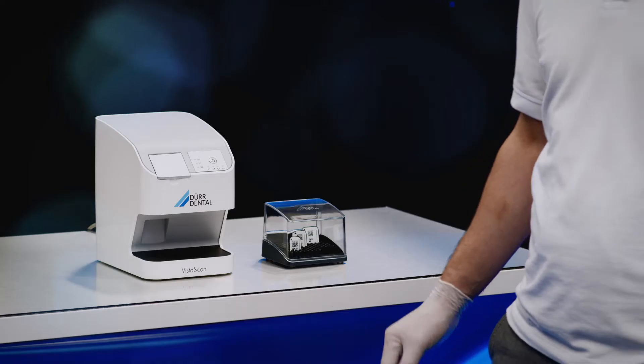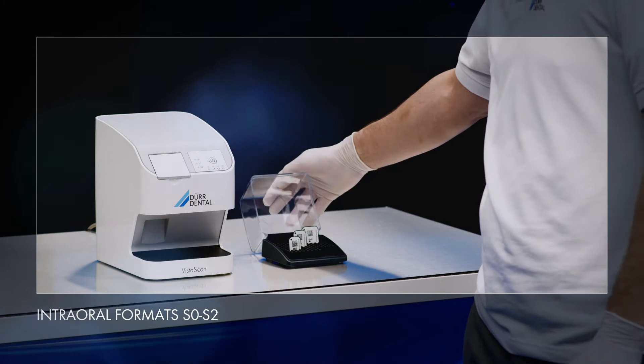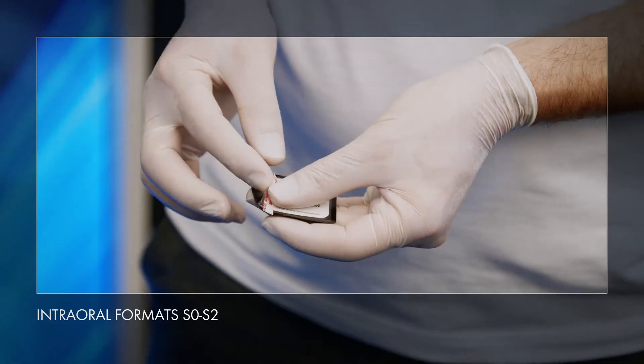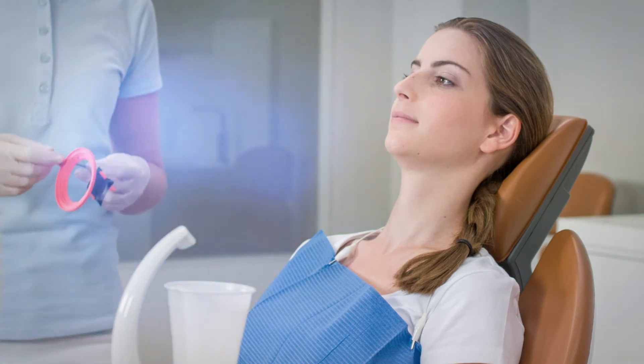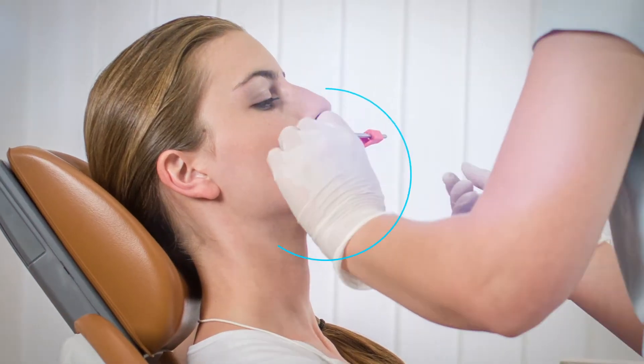VistaScan NanoEasy digitizes IQ image plates which are available in the intraoral sizes S0 to S2. DoorDental original accessories ensure reliable and user-friendly handling. The image plate holder set color from DoorDental helps to position the image plate exactly in the patient's mouth.